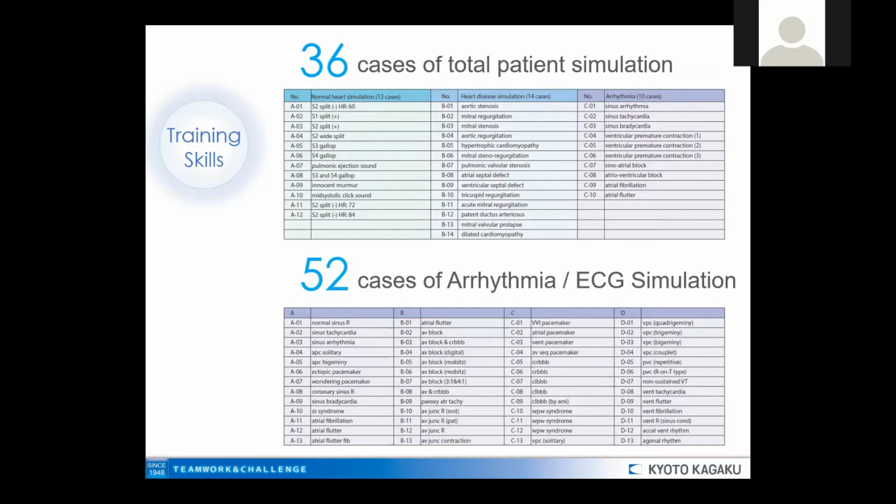And that's a huge difference, because since this part of auscultation is very difficult, because the sounds are in a very subtle and very specific way, it is extremely important to have real sounds, not simulated sounds. So please kindly make an emphasis and stress this point when you explain this product to your customers.